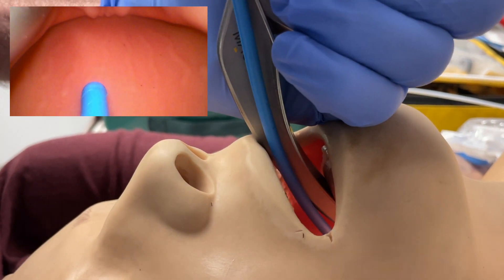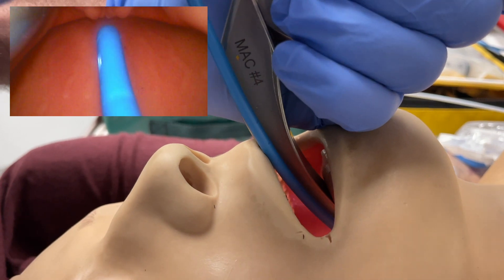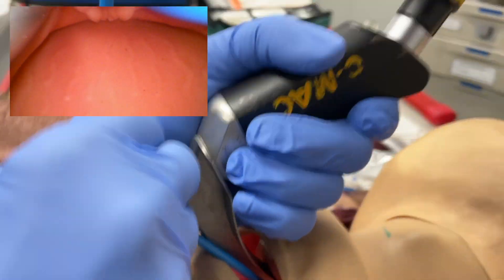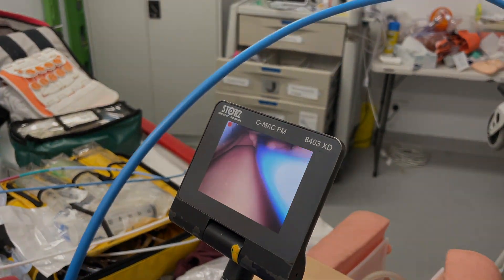So again, you push onto the teeth and the tip of the bougie tilts anteriorly. And that's why we love the throw over — these micro skills work.